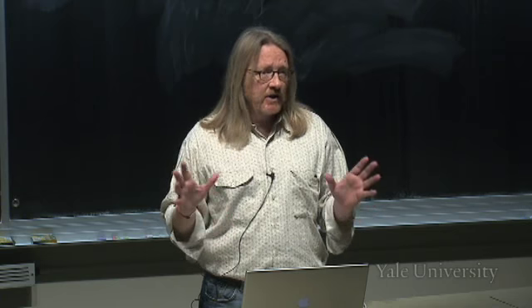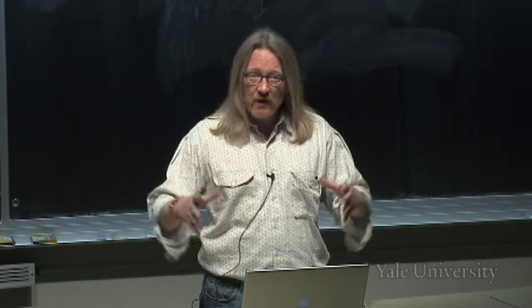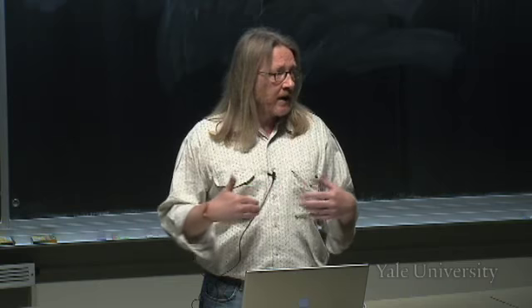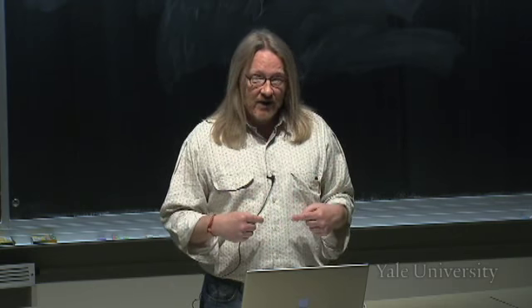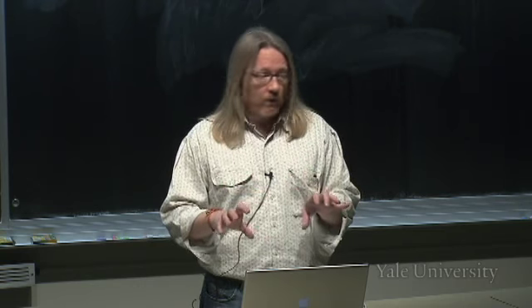One of the things I didn't talk about last time was that sometimes physicians, when they want to make images of objects where there's not a lot of intrinsic contrast, like say you want to look at the intestine, if you take an X-ray of the abdomen, everything appears like soft tissue. Everything looks about the same. If you, however, fill up the intestines with air, by feeding air to the patient or by somehow getting air into the intestinal tract, then that image will appear dark where that air is.